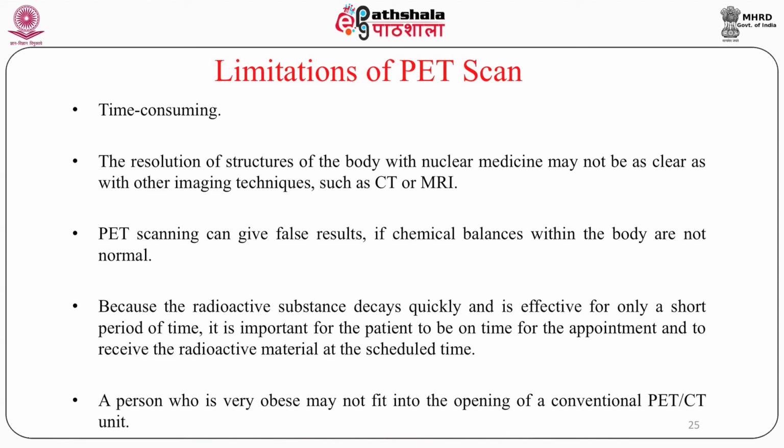In case of MRI or CT scan, the patient can go at any time and get the scan done, but that may not be possible in case of nuclear medicine examination, and apart from PET CT, because the fluorine-18 which is required has a short half-life. If the fluorine-18 is not there in the department, the scan cannot be done. So, if the fluorine-18 is already labeled with a compound and the patient is not there, he is going to miss it. So, these are the limitations of the PET scan.